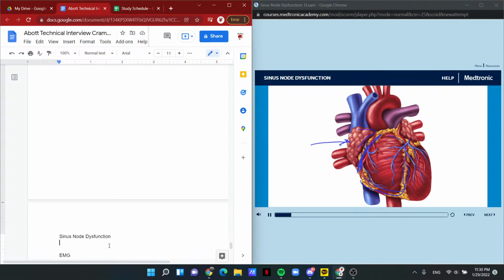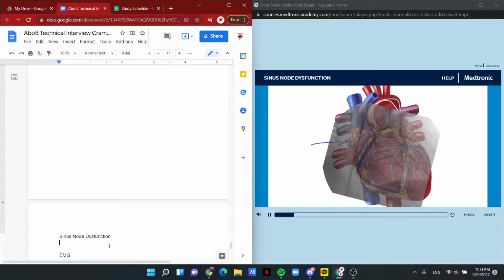We can actually slip a catheter up the aorta and take a picture of the right coronary artery during a cardiac catheterization. And I can now superimpose that image over the heart. Here is the catheter coming down, engaging the ostium of the right coronary artery. Here is the main body of the right coronary artery that runs around the right AV groove to the back of the heart, or the crux of the heart, and then becomes the posterior descending artery. It runs towards the apex.